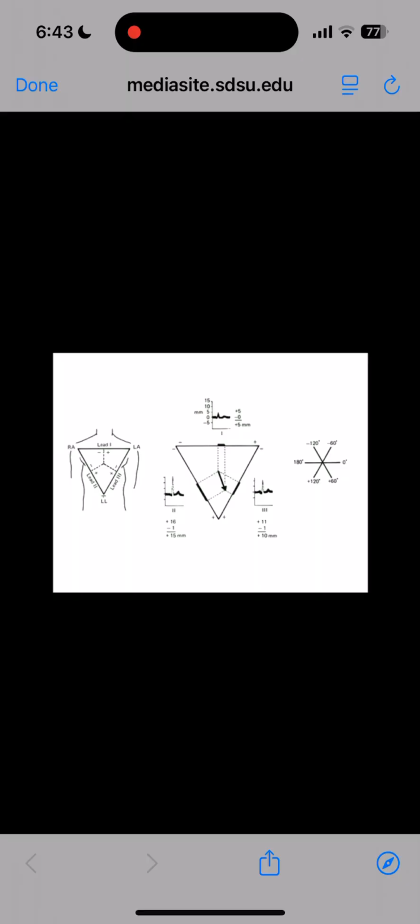Well, so now if we go on and we say this is sort of the average dipole of the heart, what we could see is that from the very top, you're not going to see much of the dipole. I don't know if you can see the toothpick sticking out back here. You're only seeing a tiny little section right up here. And because you're looking down at it, when you're looking at lead 1, you're only going to get a small upward deflection. When you're looking at the side, lead 2 goes this way, you're looking at it in this direction.